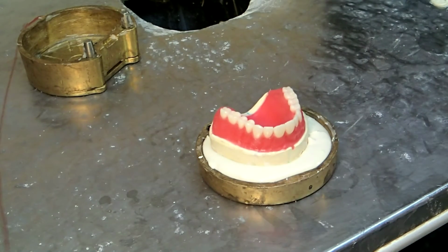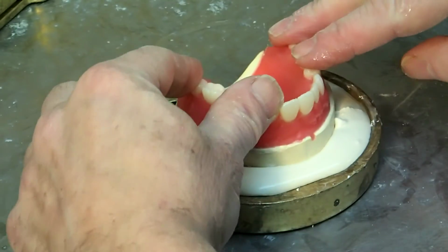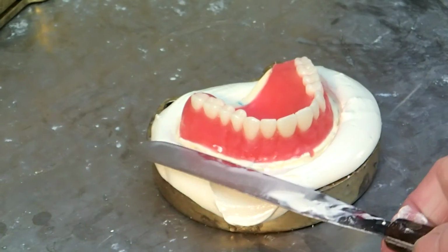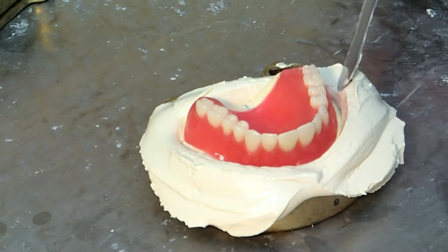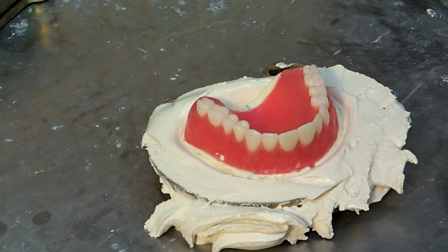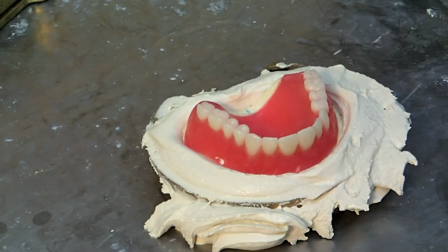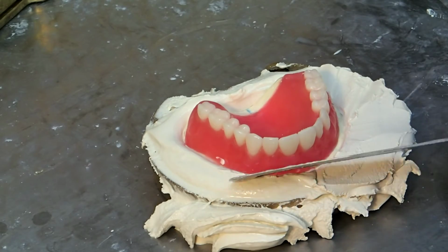So I put the denture down into the stone, and I'm just going to seat the denture into the stone. Just going to push it down gently. If my stone is fairly thick, you can see how it kind of rises up around the model and makes like a rounded wave. What I don't want is for the denture to just sink right through that stone and then have the stone flow all over the wax. I want my wax to stay nice and clean. I don't want any of the stone to get onto the wax. So by having a fairly thick mix that kind of curls away from my denture, it makes it a little easier for me.